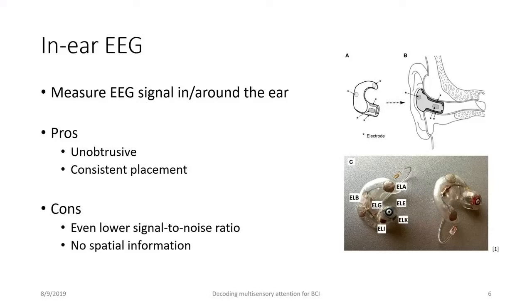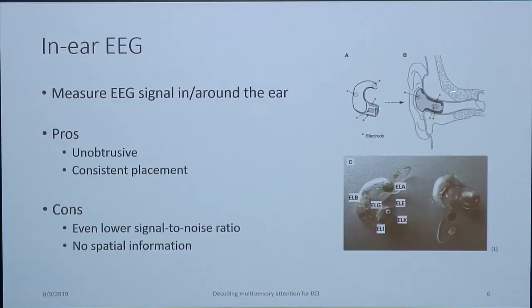And an alternative way of collecting EEG data, as you can imagine, the whole brain is a conductor. And if we can measure the signal here, probably we can also measure the signal here. So an alternative way is to place some in-ear electrodes with conductive materials contacting your ear canal. And here, probably some signal will transmit from the brain to here and could be captured by these in-ear EEG electrodes. And there are a lot of advantages of using that.